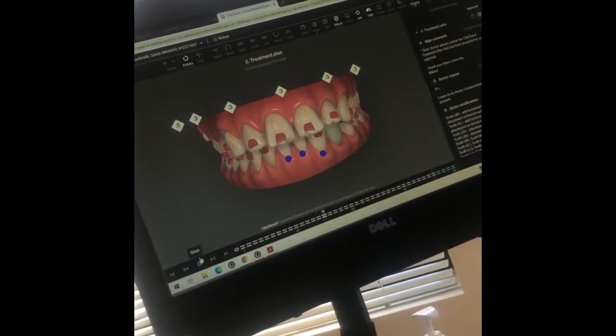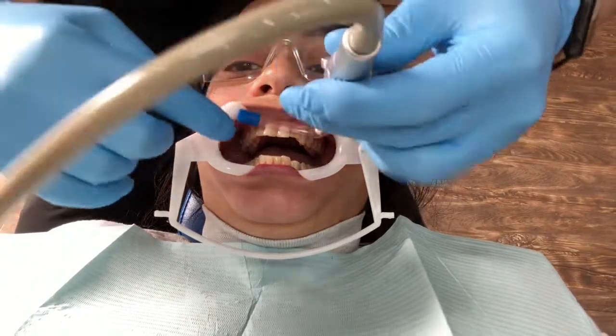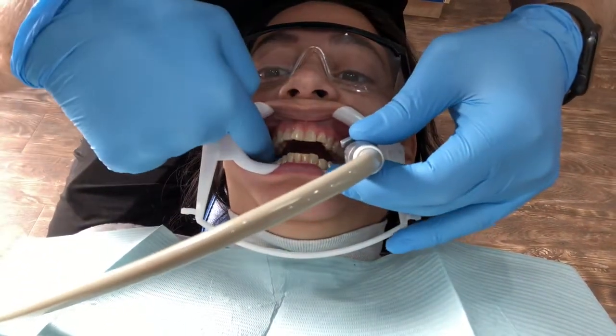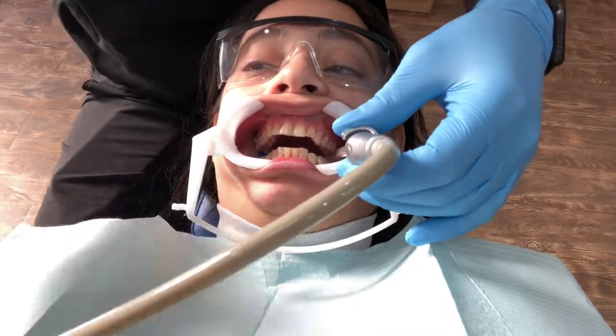This is just the model of what my teeth look like now and then what they're gonna look like when I'm done with the Invisalign. Here's the prep to clean my teeth so that when he puts on the brackets they stick, and that's what's gonna hold in my trays. That's what he's doing.